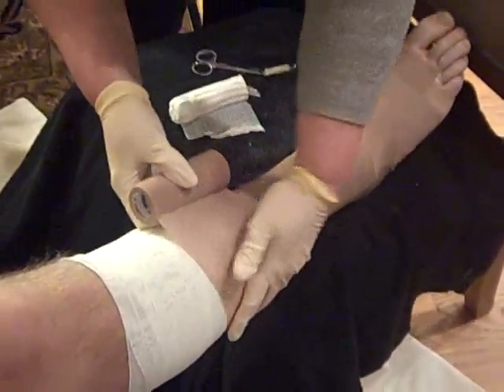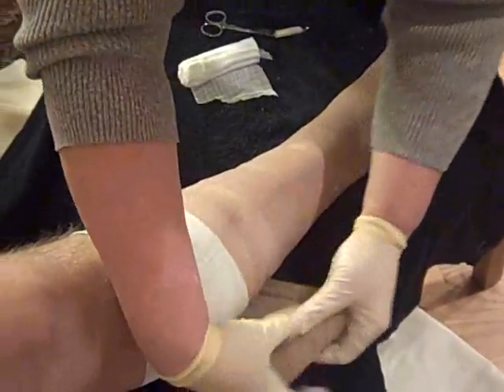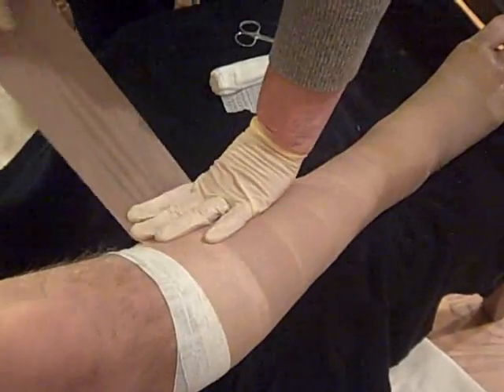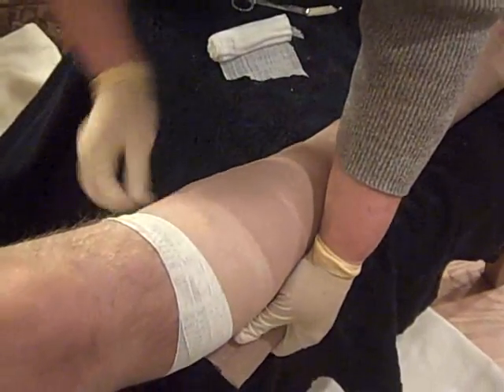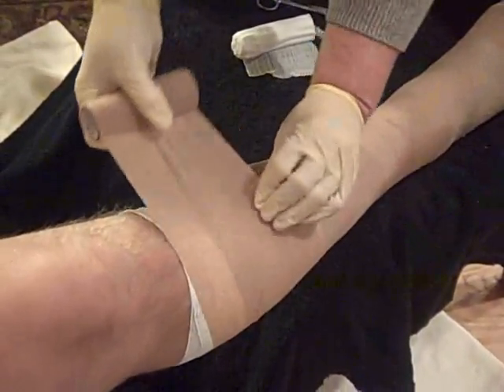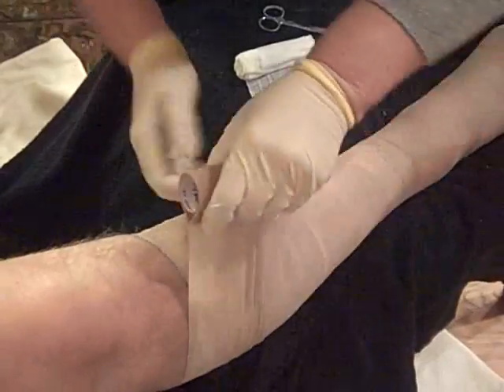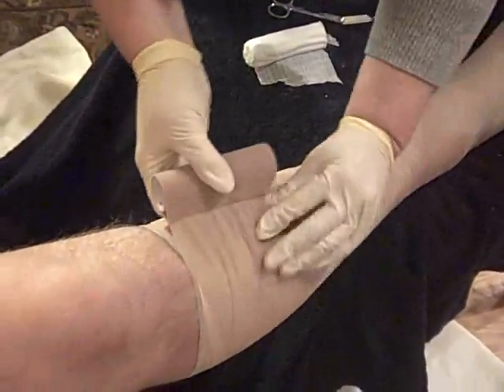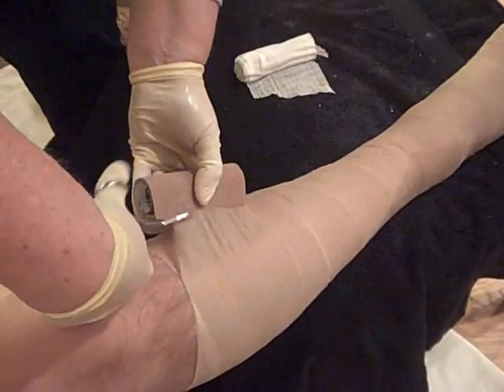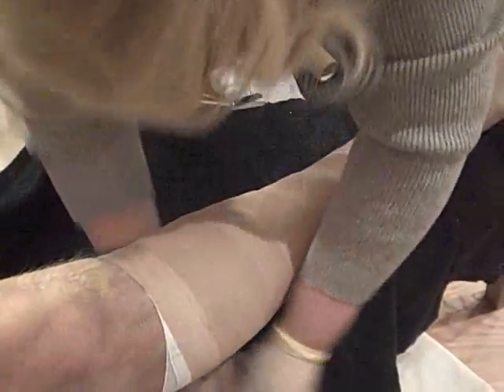Again, maintaining a wrinkle-free application — we don't see wrinkles from our angle. And how far do we go with this? Again, you're only going to go to about one inch below the knee. Now here's the key: we are going to have excess left over. You don't want to keep wrapping that around because it's like applying a tourniquet. So you're going to cut off the unused portion and secure it with tape.